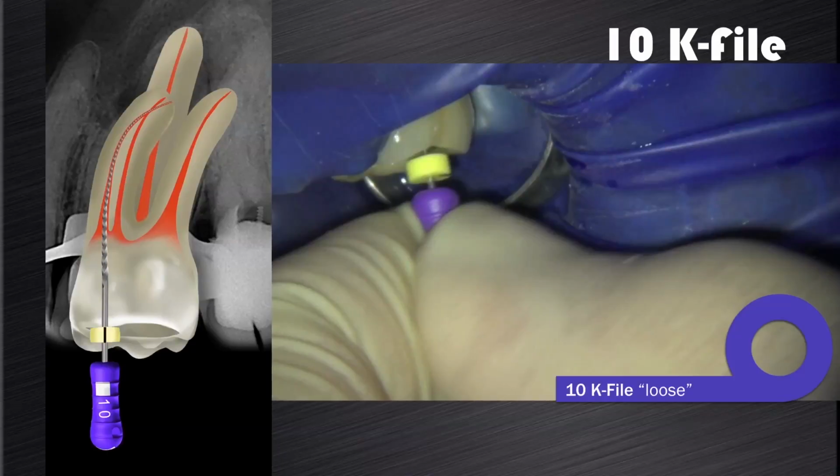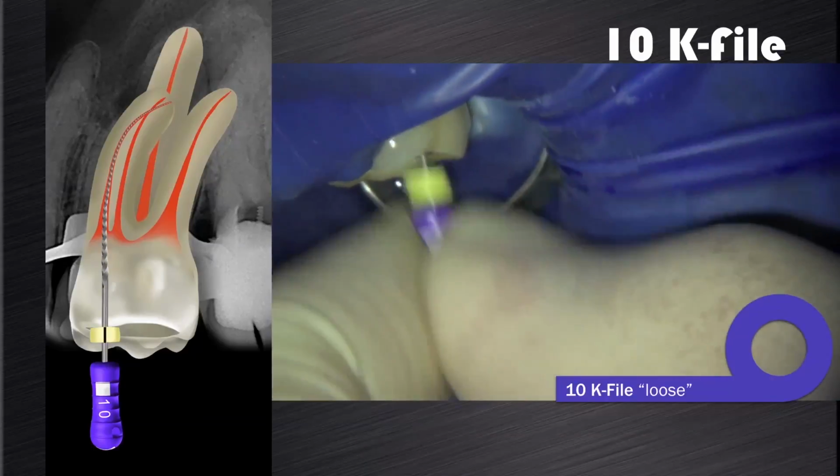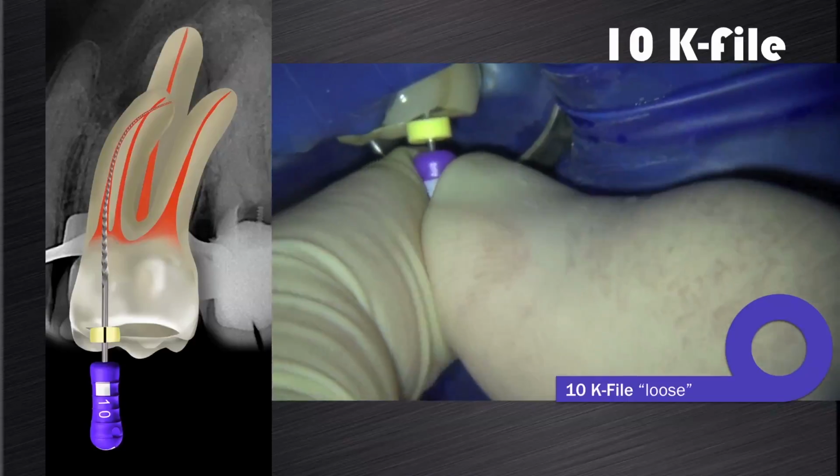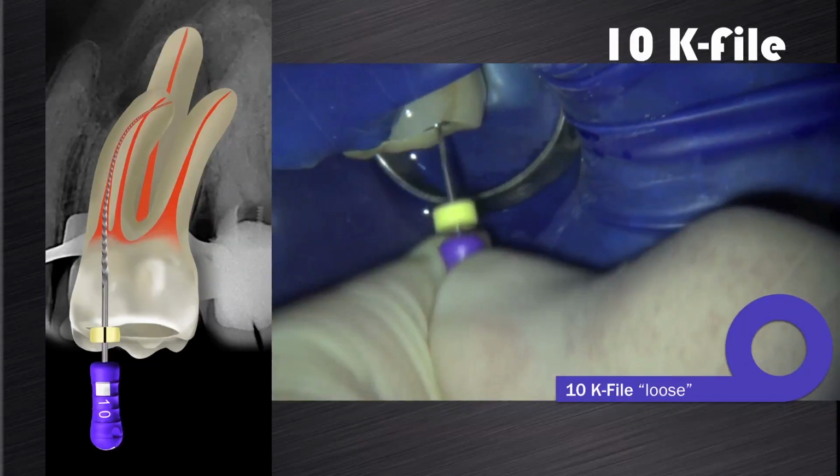In these types of canals with an irregular glide path, it is advocated to take an 08 or 10K file to full working length, and then using small amplitudes, we have to make the file loose at 1 mm, then up to 2 mm, 3 mm and 4 mm from working length, according to the technique described by John West.